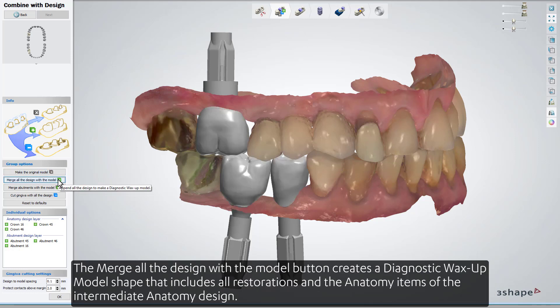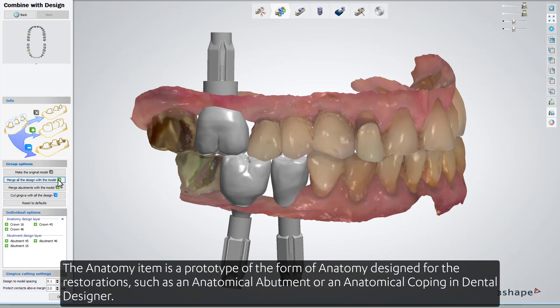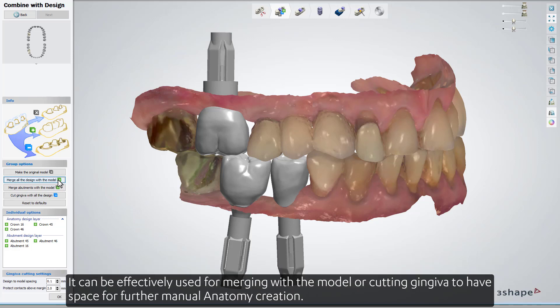The 'Merge All the Design with the Model' button creates a diagnostic wax-up model shape that includes all restorations and the anatomy items of the intermediate anatomy design. The anatomy item is a prototype of the form of anatomy designed for the restorations, such as an anatomical abutment or an anatomical coping in Dental Designer.